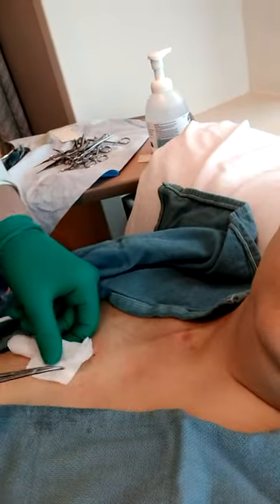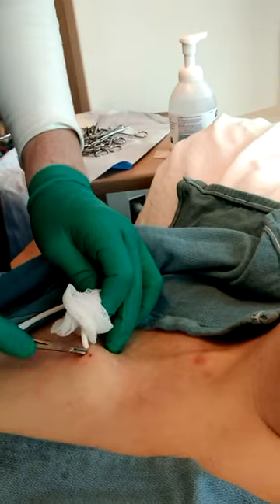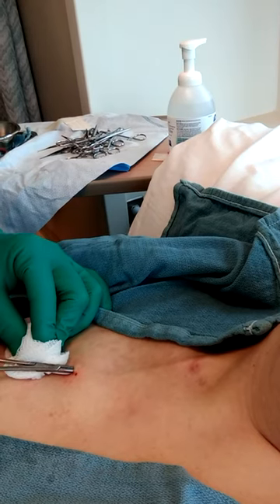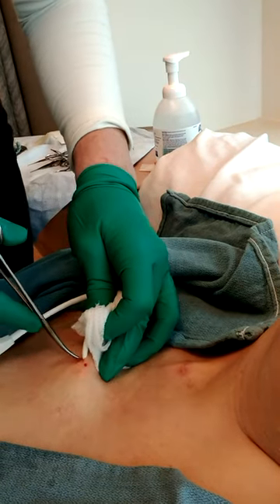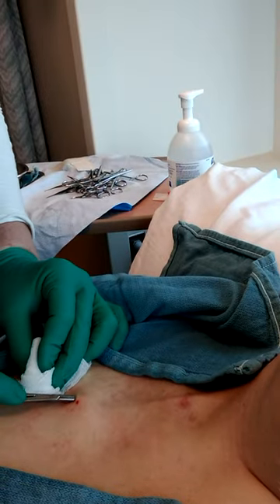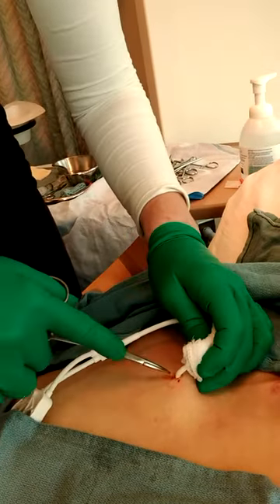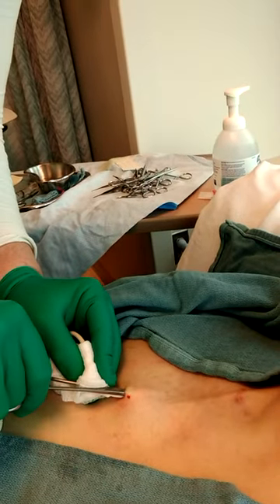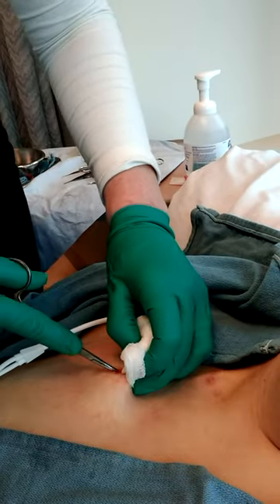Just stretching your skin until I find the cuff. When I find it, you'll just gently pull the tissue away from it. This is why I have to freeze so high up, right? Because it's up there. I can see it.